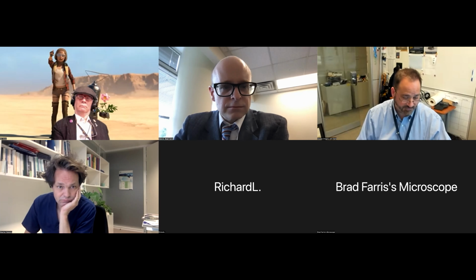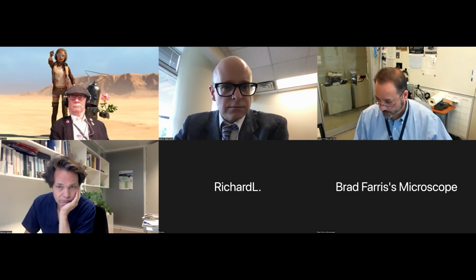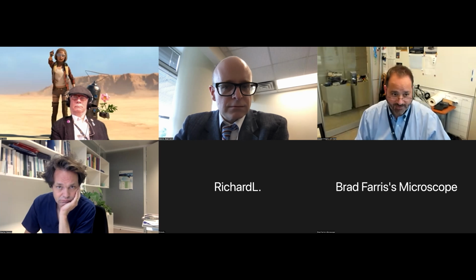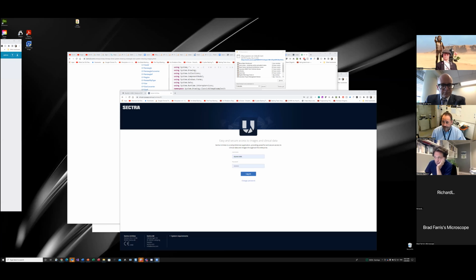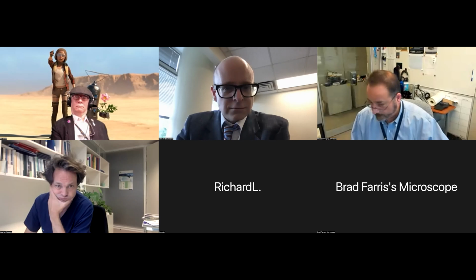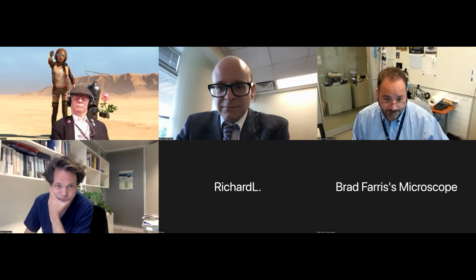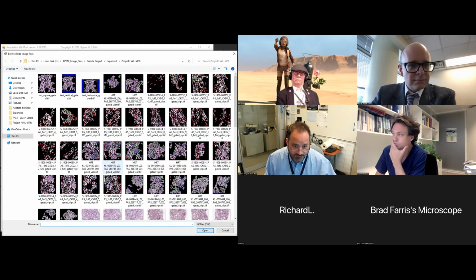Let me get this running again. So those are the pathologist scores. But there's the share thing. There we go. There it is. So, the output of the whole pipeline, which I didn't show you, looks like this.